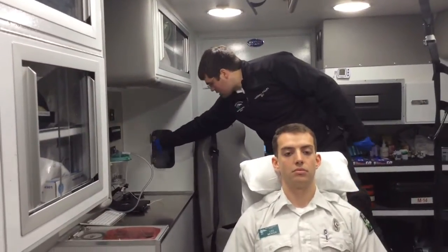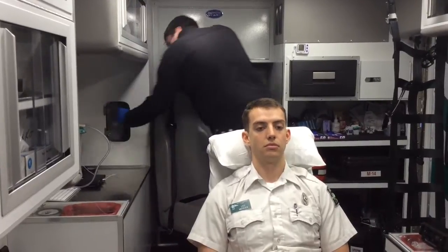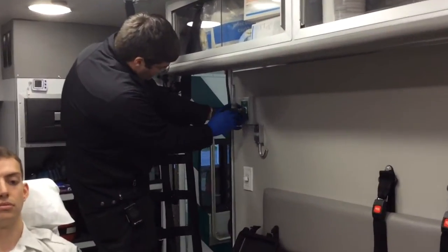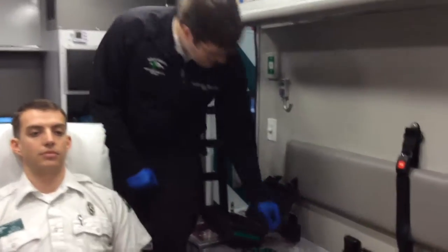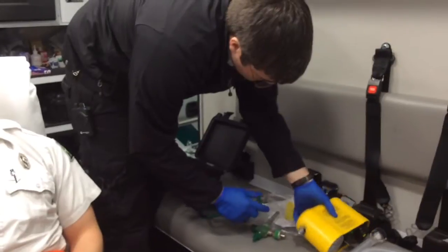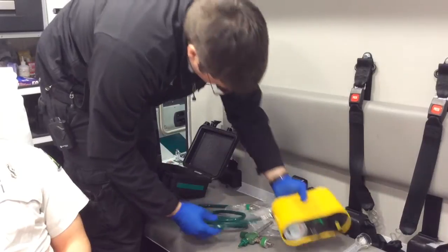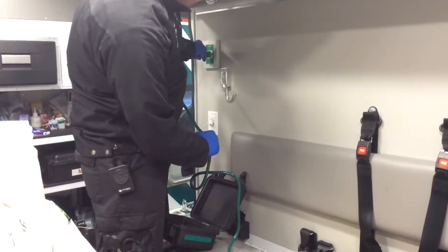We start by making sure the air is on. We're going to be using this port. Start by removing the tree — the green portion on the tree rotates and it unlocks. First, verify that you have a quick disconnect on your hose. Attach the other end of the hose to the CPAP, and make sure it is hand tight to avoid leaking. Then connect the quick disconnect to the wall port.